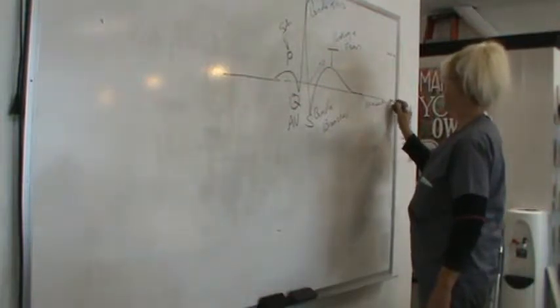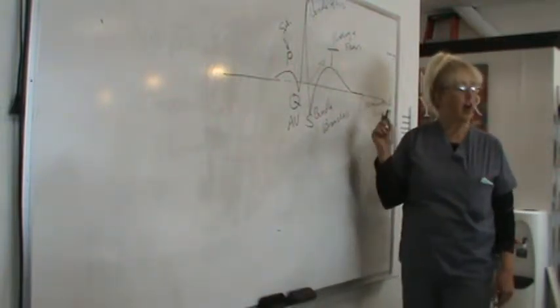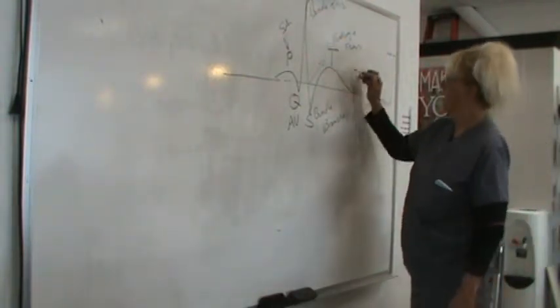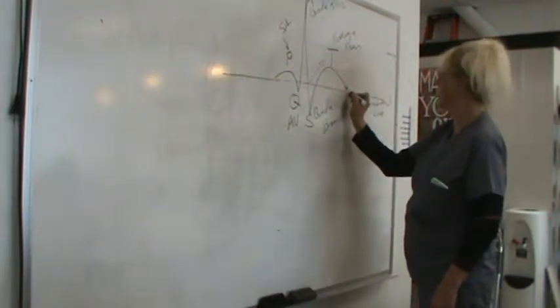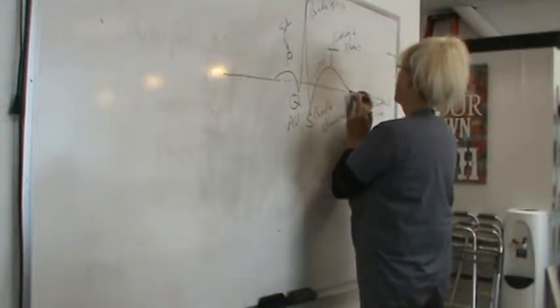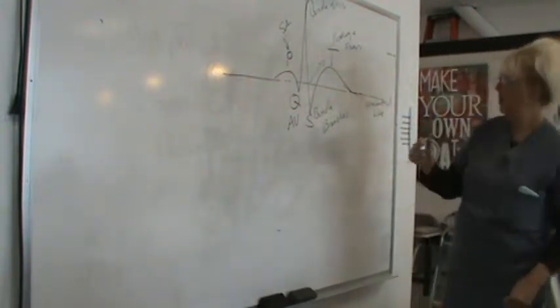Isoelectric line. We have to come to 0 for the heart to rest. Right? We have to come to 0 for the heart to rest. So right here, where you can draw a tangent line with the slope of this curve, right? A tangent line connects a curve at one point. That's how we define tangent, right?